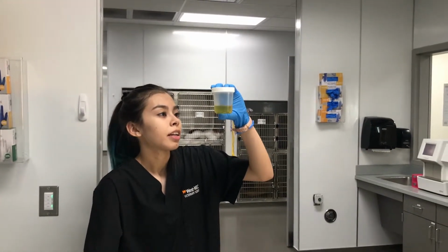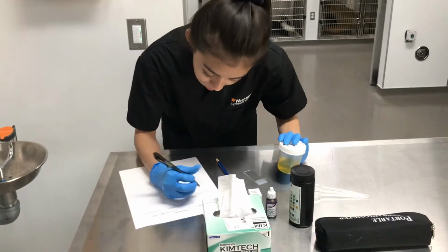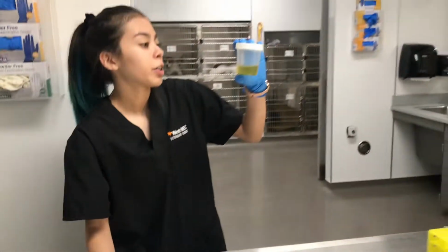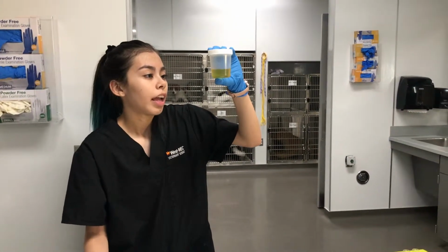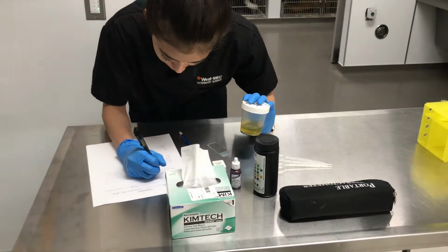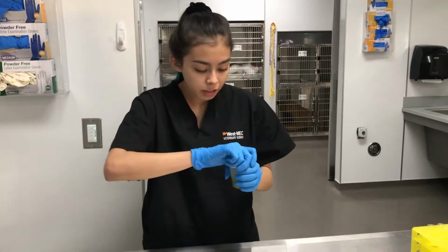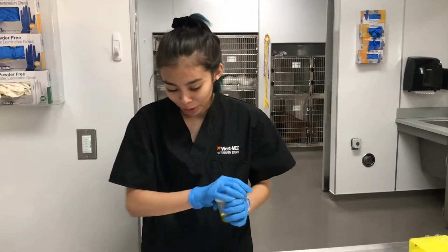So I'll look into the pee, and this pee is more dark yellow, so I would write that on the patient's record. And I'll also be checking for clarity or turbidity, which means how cloudy or clear the pee is. And this urine sample is slightly turbid. And the last thing for the visual inspection is odor, so I'll have to smell the urine sample. And this is a strong odor.